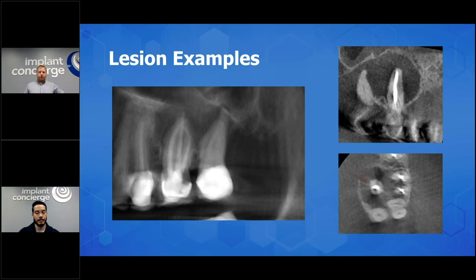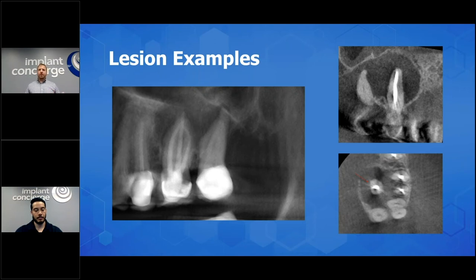What are some of the findings here? It's corticated, it's nice and round, there's expansion into the maxillary sinus.